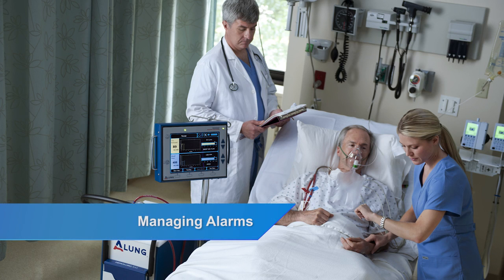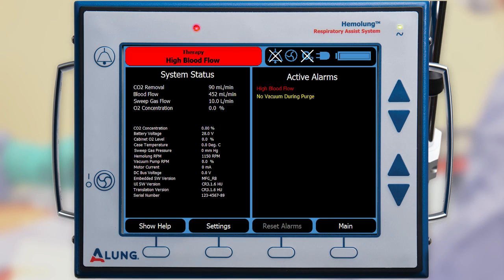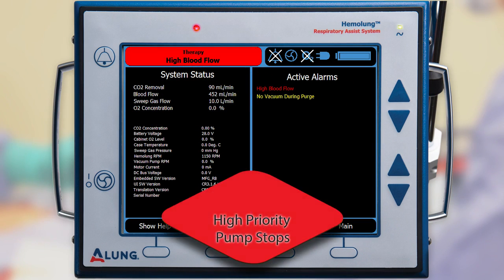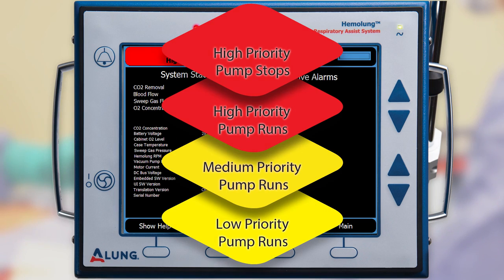Managing alarms: alarm notifications are prioritized by the device. The highest priority alarm has precedence over any others if multiple occur, and only the highest priority alarm is listed in the notification area. High priority alarms are red; medium and low priority alarms are yellow. High priority alarms notify you of an urgent safety hazard that could result in diminished or loss of therapy — an immediate response is required. In certain cases, the pump is stopped to prevent harm to the patient.